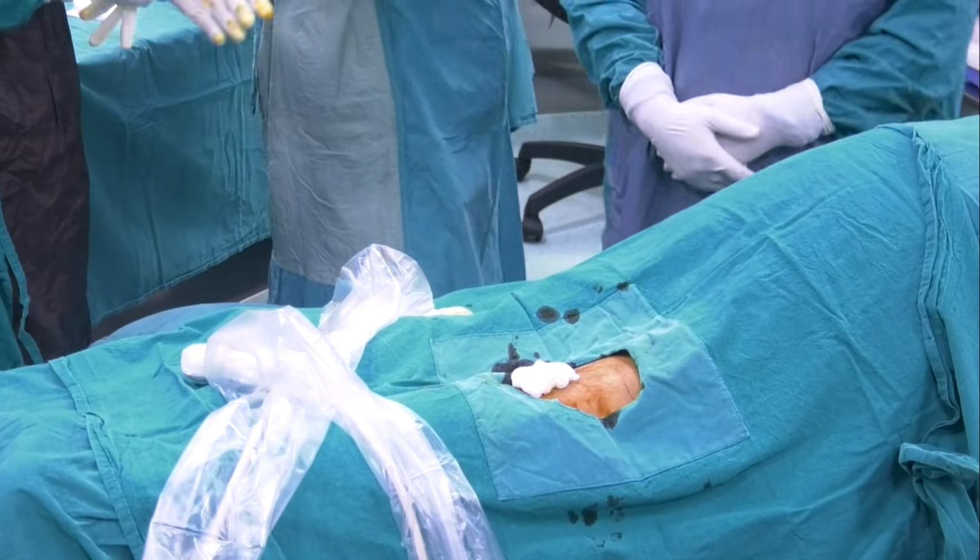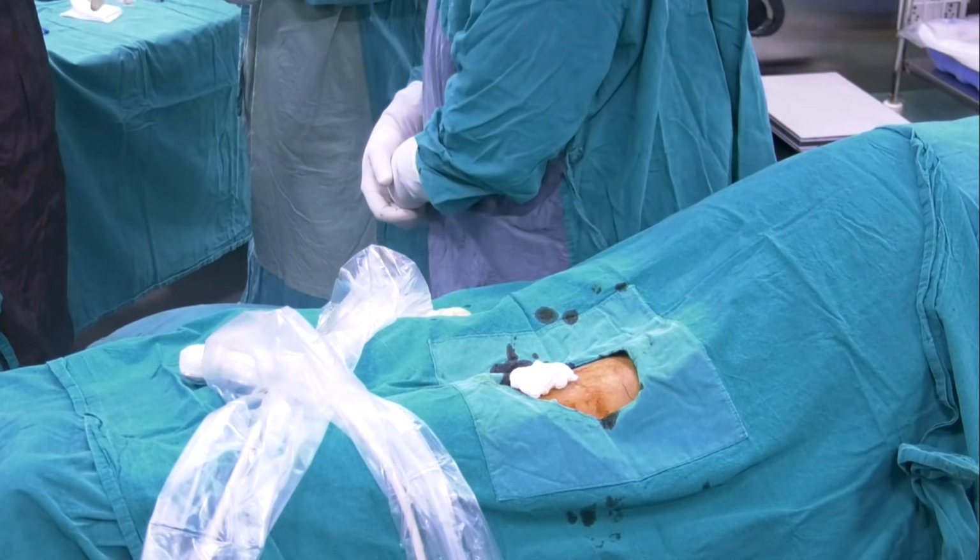Ultrasound में उतना clear नहीं है. Machine is not. Sir, can we take some questions? Yes, yes, questions.